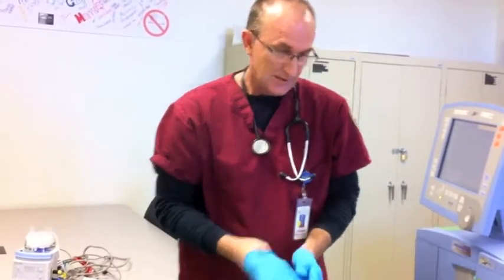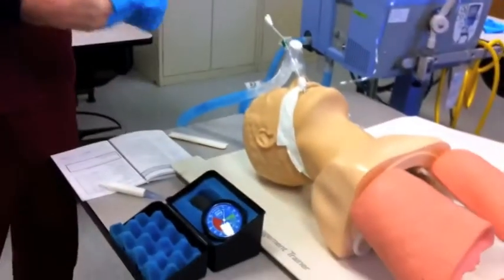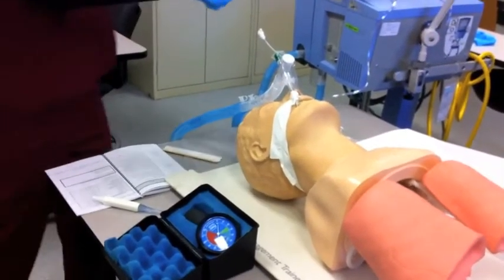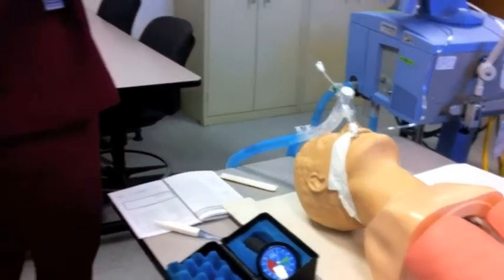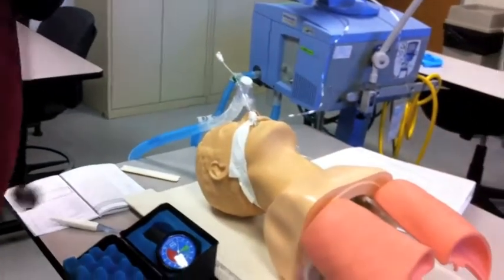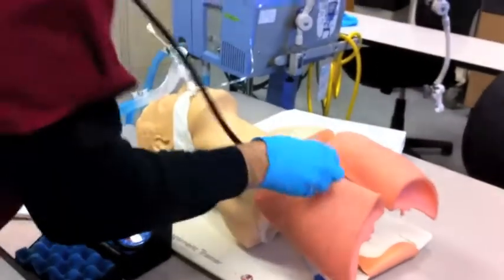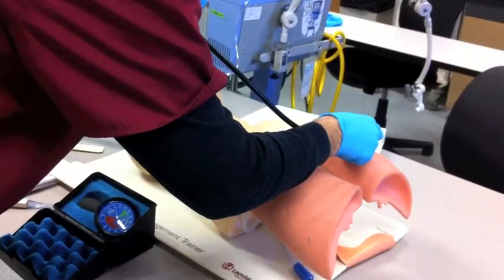Next, he's going to assess the patient. He's going to check for the patient's color, vital signs, level of consciousness, and breath sounds. Breath sounds are very diminished.